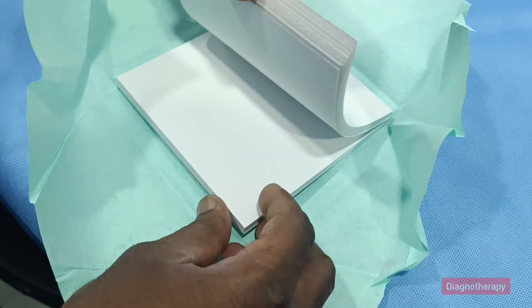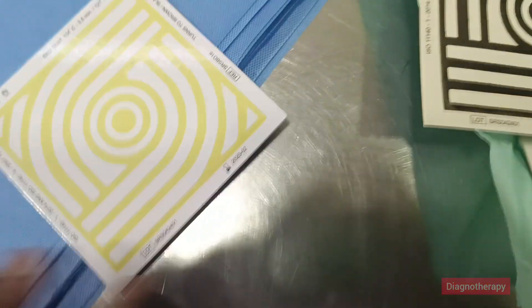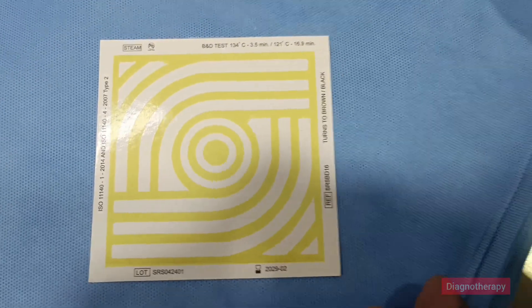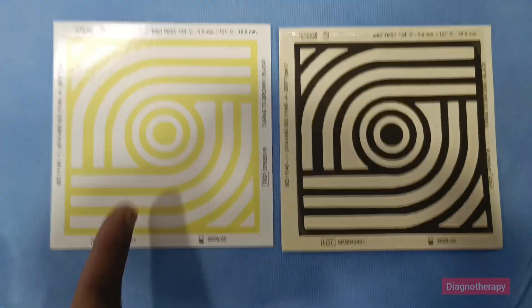The initial color is yellowish, then it changes to a different color. The test is shown in this pattern, and when it gets sterilized, it turns to black color.